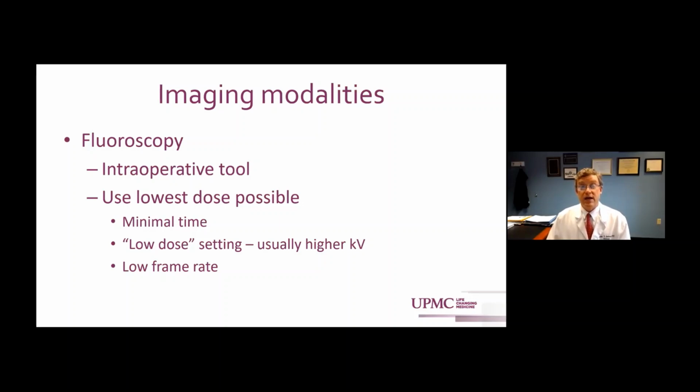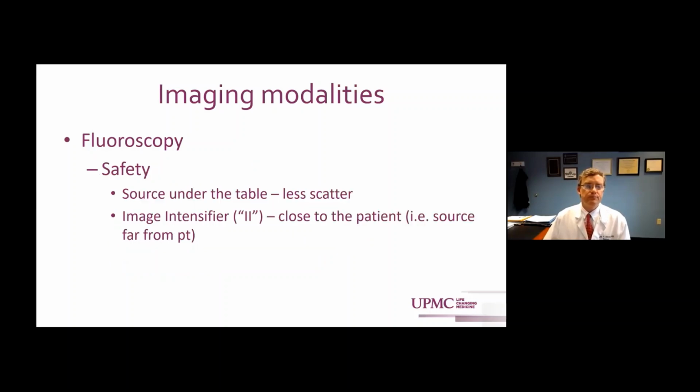There's always a low dose setting, so do try to choose that. And most of these machines can be set to a low frame rate as well. And you can set the frame rates down to really fairly ridiculously low numbers and still get adequate imaging for at least guidance of, is my wire in, and things like that. That can dramatically decrease some of that.